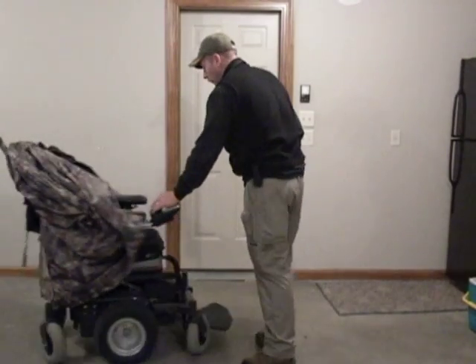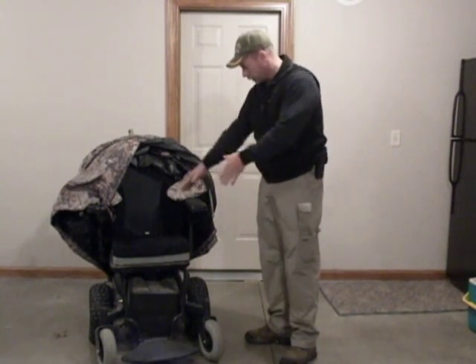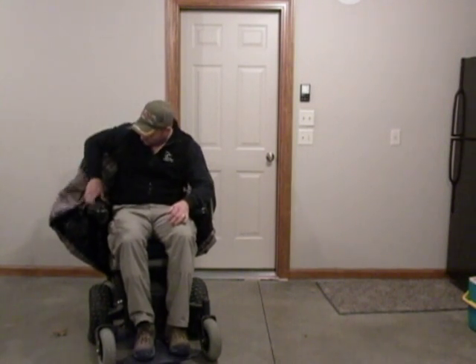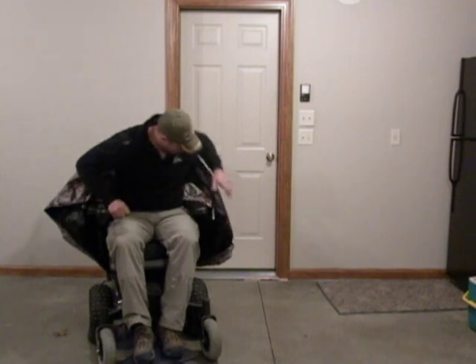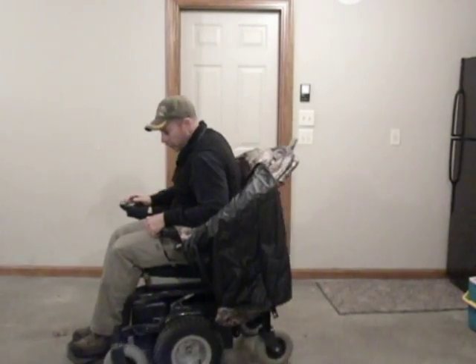Now at this point it's all ready to go. Noah can just transfer into the chair. Once Noah has positioned himself and he's in the chair, everything is right there on his side. He's ready to go. He can drive himself around, and everything stays clear of his joystick. He doesn't have anything in the way.